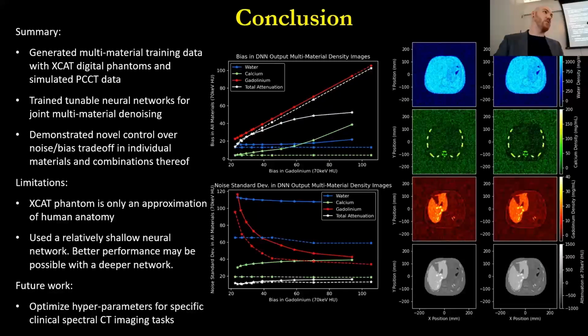And yeah, I appreciate the suggestion on the frequencies. I think you have to do such tricks when you want to go into clinical routine. You cannot offer a slider that tells the radiologist either noisy with correct CT values, or wrong CT values and low noise. Yeah, that was the motivation for this second protocol that tries to strongly penalize bias in those attenuation images, because I can see why that would be just completely unacceptable. If in the monoenergetic attenuation images, the CT value was changed, it's not going to be all right.